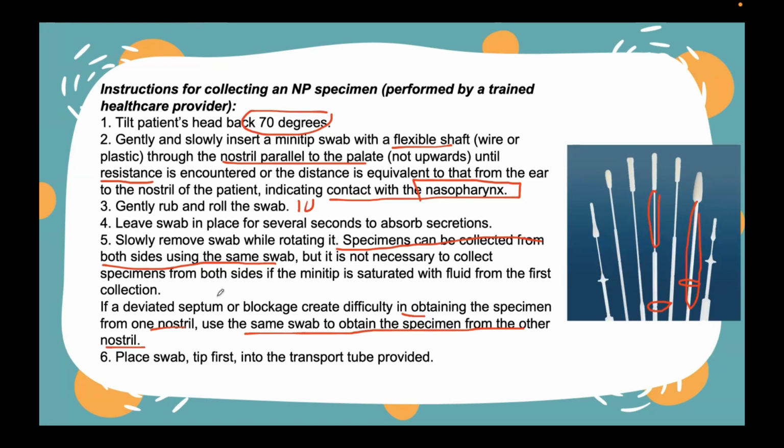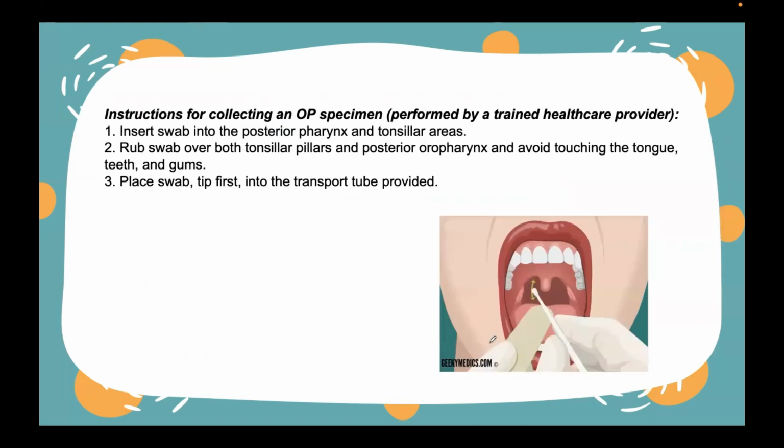Okay? And then place the swab tip first into the transport tube provided. So yung VTM mo, ilalagay mo na agad directly once na nakakolect ka, pataob. Okay? Place the swab tip first. Yung tip, dapat siya yung nakasubmerge doon sa parang culture media.